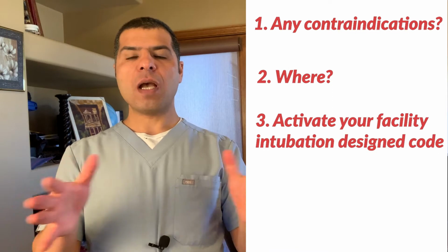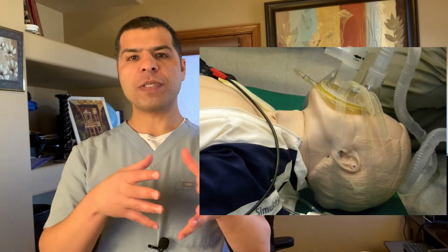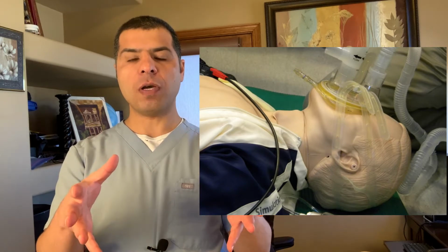Now the patient is down in the ICU. He was already on CPAP, requiring 12 centimeters H2O and 100% FiO2. So he was already on the maximum amount of oxygen. He was still awake and breathing, so I kept him on that.